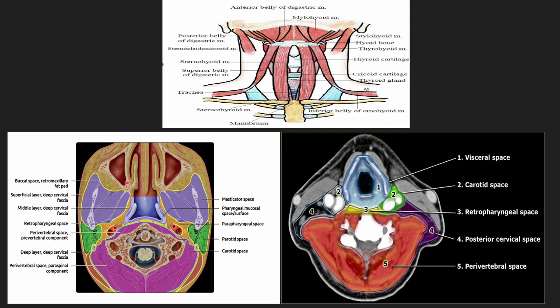This is the section taken at the suprahyoid neck. Laterally we have the masticator space highlighted in purple, and posteriorly we have the parotid space highlighted in green. Anterior to the masticator space we have the buccal fat pad or the buccal space. These three spaces are exclusive for the suprahyoid compartment. In the center we have the pharyngeal mucosal space, which continues downwards as the visceral space in the infrahyoid compartment. Posteriorly we have the perivertebral space, divided into prevertebral and paraspinal space. In the center we have the carotid space, and medial to the carotid space we have the parapharyngeal space.